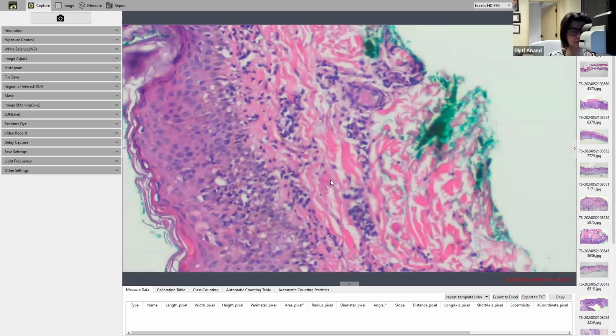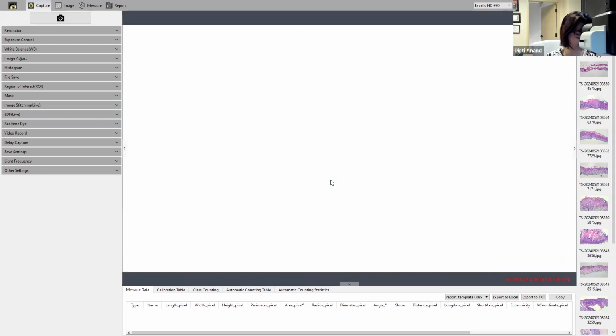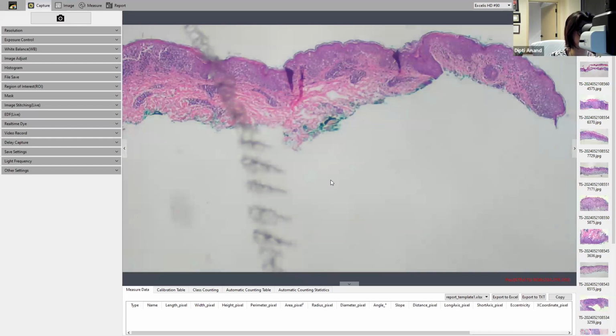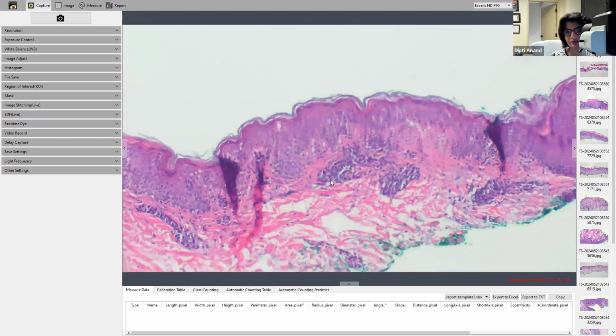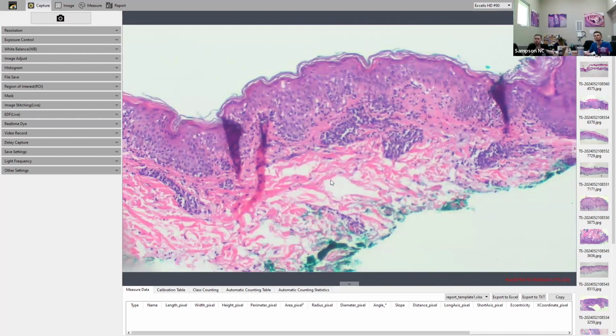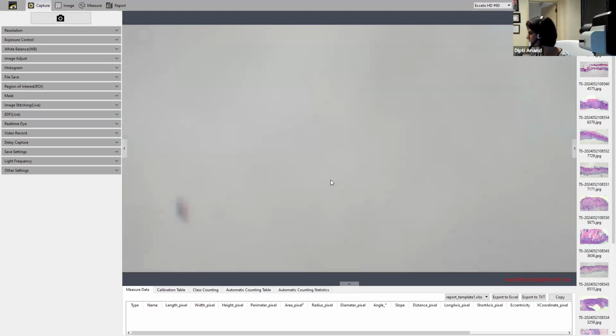But really, the lymphocytes in the epidermis are so much more prominent than in any other interface disease. The dead cells in the epidermis are occurring because of lymphocytic exocytosis, but for some reason it's more prominent in the pityriasis lichenoides group of diseases. You got it? Got it. That's a good one. Yeah. So your homework for today is to go back and look at all these slides and chalk out the acute and the chronic. Sounds good. We'll do it.